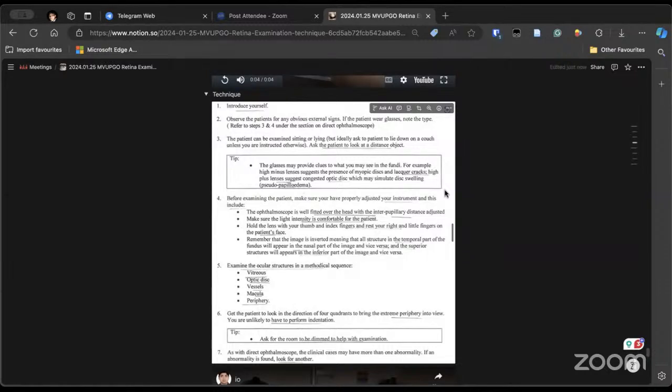And all of you know, I have told you about this lens, the white mark will face the patient, and you examine the periphery first. Though it is for the same thing, if you examine the posterior pole first, the patient will have difficulty, they will be uncomfortable, and the pupils will constrict if the patient is dilated. And in the exam, what happens is that patients are there for a long time, and they have been getting examined.